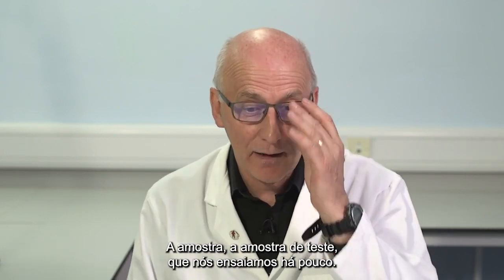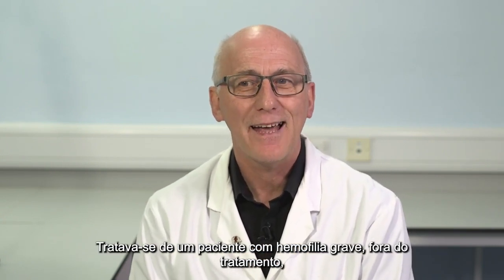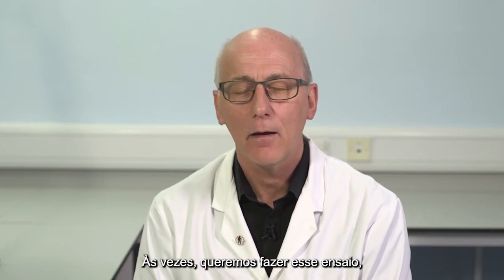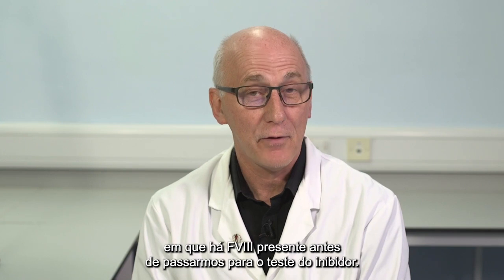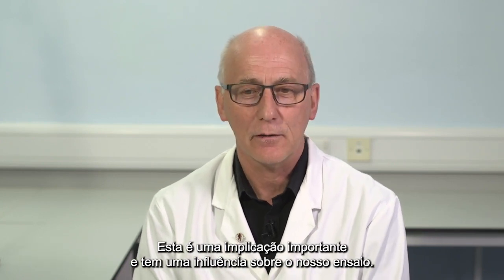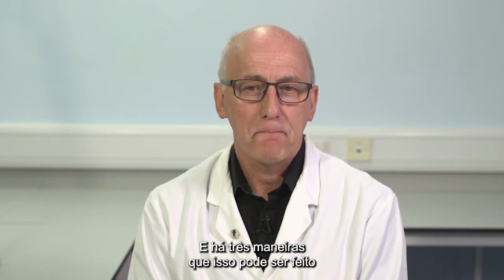The test sample which we assayed just now was from a patient with severe haemophilia outside of treatment, so with no factor VIII in the test sample. Frequently we want to make this assay in a sample in which there is factor VIII present before we move into the inhibitor test. And this has an important implication and has an influence on our assay. We need to take the level of factor VIII into account. And there are 3 ways that this can be done.